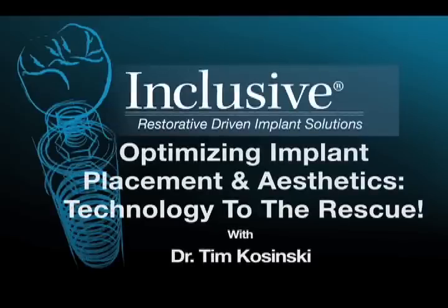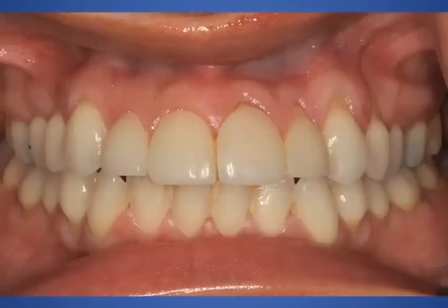Implant dentistry has gone through many innovative changes over the past few years, and one of the most prominent is CT diagnostics. We can now use a CAT scan for three-dimensional implant treatment planning and actual surgical placement of our dental implants.